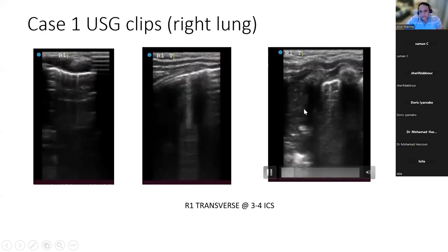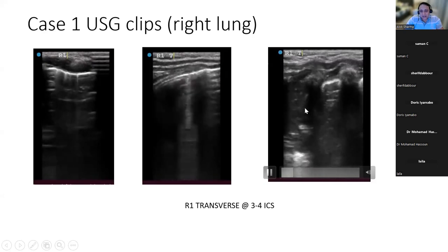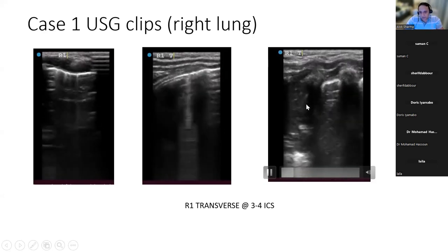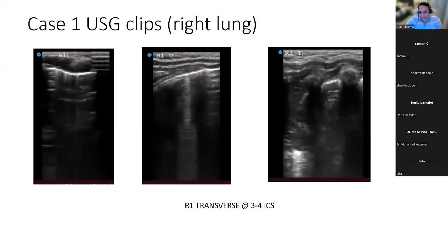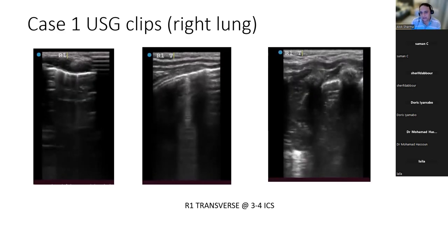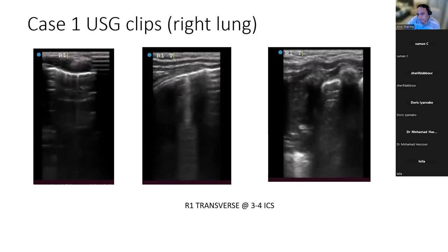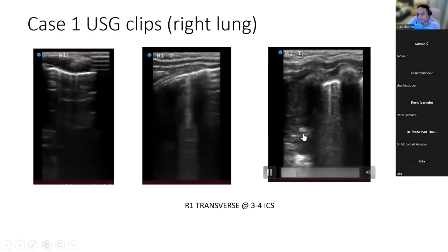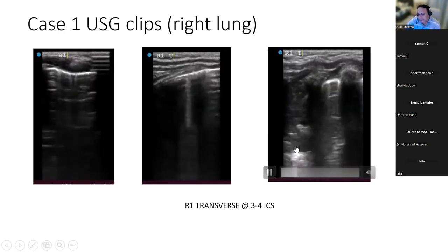As you move up, the texture becomes more tissue-like. And this is quite high. Often when the thymus comes into contact with that zone, the thymus can also appear like that. So for me, it's a right upper lobe collapse consolidation, probably intermixed thymus, because can you see there's a small blood vessel at the bottom? Come right. Further down.